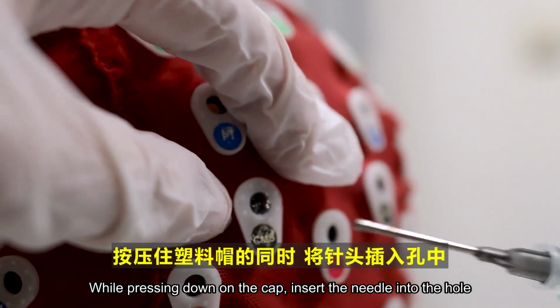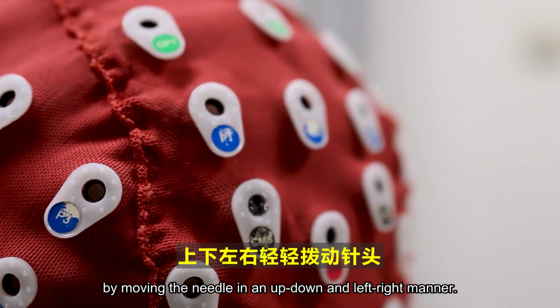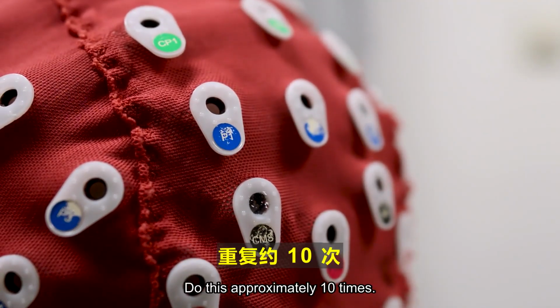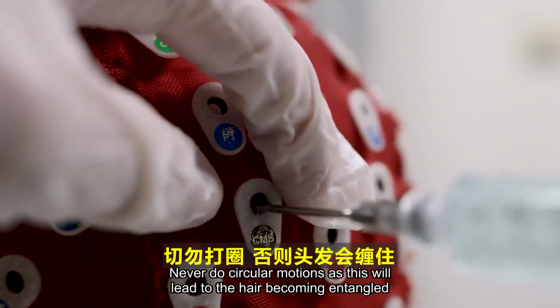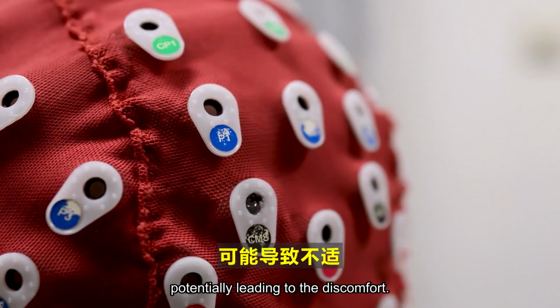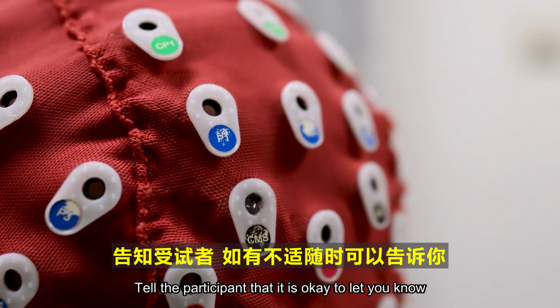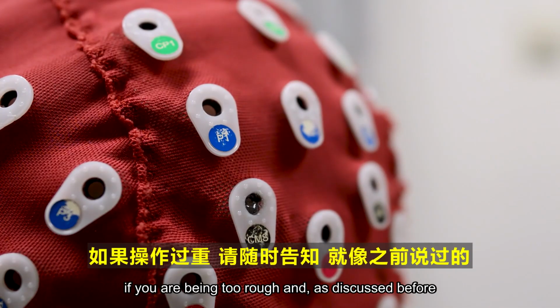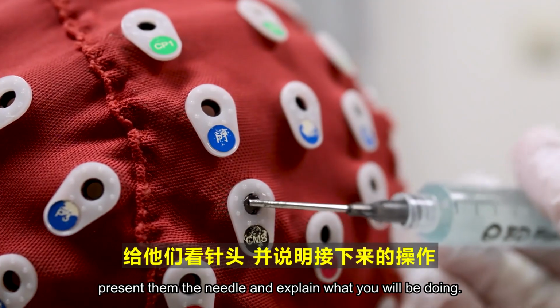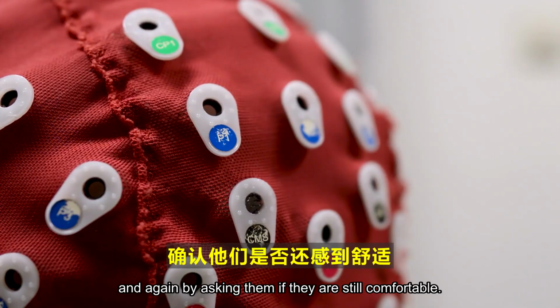While pressing down on the cap, insert the needle into the hole and gently move the hair by moving the needle in an up, down, and left-right manner. Do this approximately 10 times. Never do circular motions, as this will lead to the hair becoming entangled and pulled through the cap, potentially leading to discomfort. Tell the participant that it is okay to let you know if you are being too rough, and, as discussed before, present them the needle and explain what you will be doing. Make sure to check in with them every now and again by asking them if they are still comfortable.